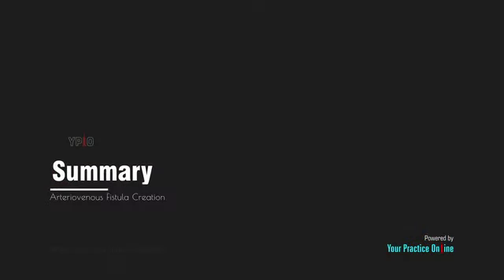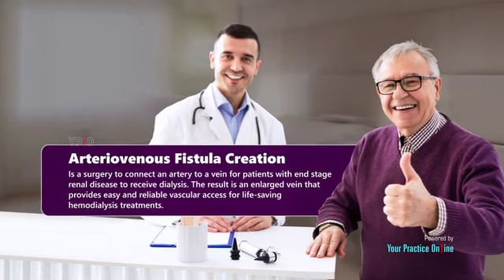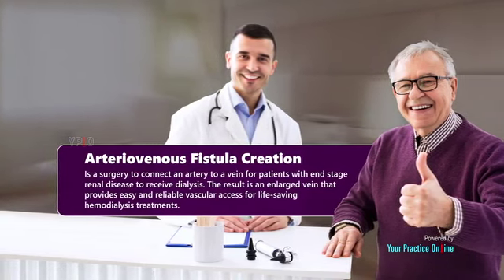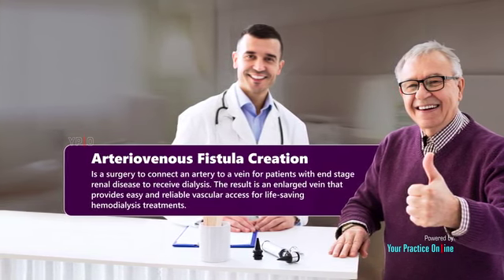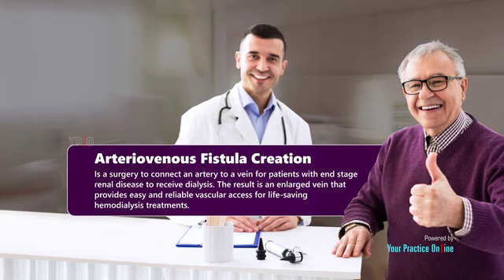Summary. An arteriovenous fistula creation is a surgery to connect an artery to a vein for patients with end-stage renal disease in order to receive dialysis. The result is an enlarged vein that provides easy and reliable vascular access for life-saving hemodialysis treatments.